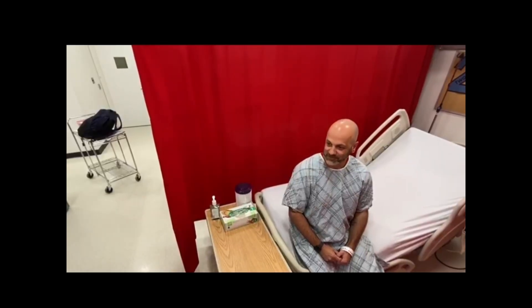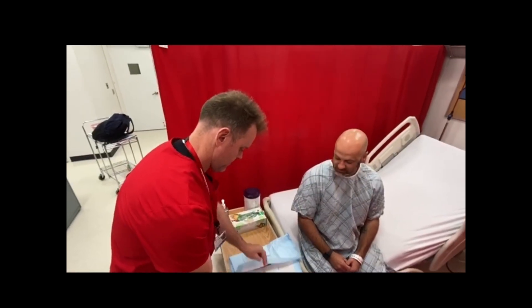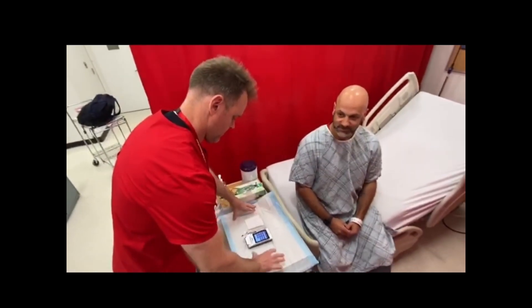Enter the patient's room. Ensure a clean field is available. Place and open supplies on the clean field. Designate an area for the dirty field.